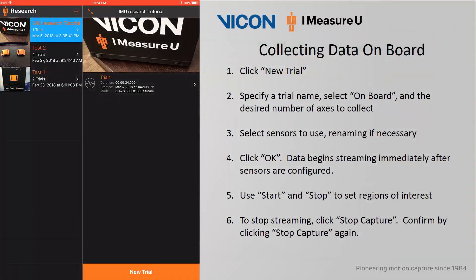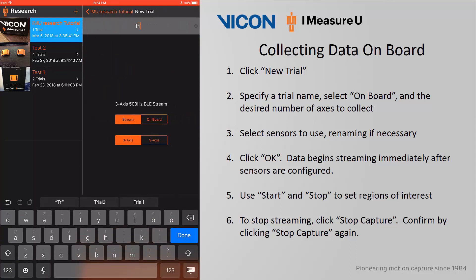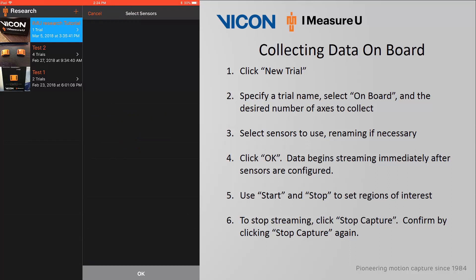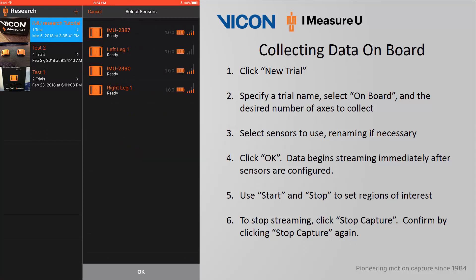In this next example, I will choose to save data to the onboard sensor memory and record 9 axes. I will click on New Trial, specify a trial name — in this case Trial 2 — select Onboard and 9 axes, and then click Start Capture.